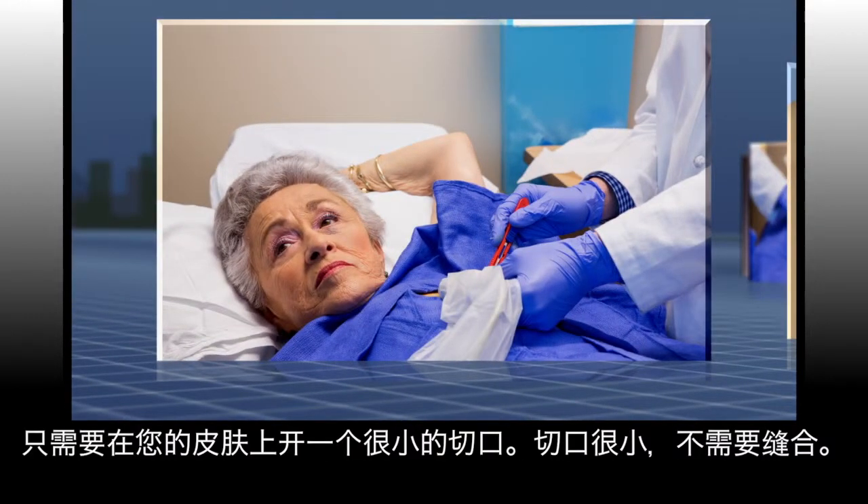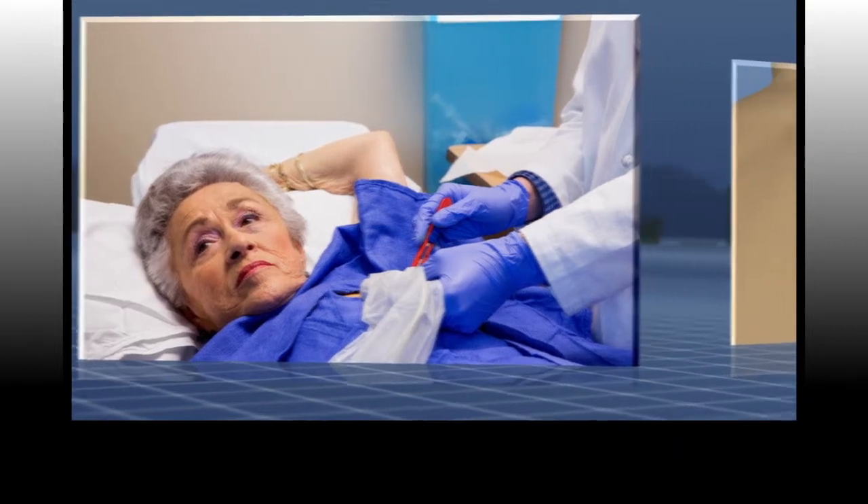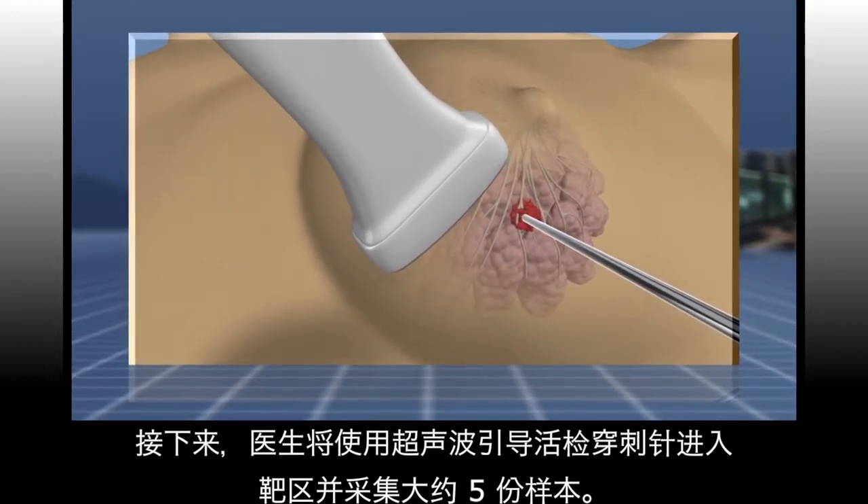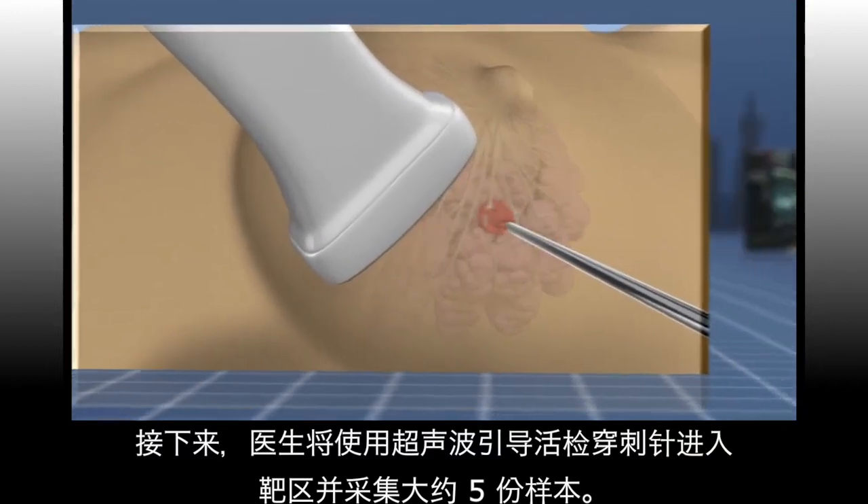An incision so small that it doesn't need stitches will be made into your skin. Your doctor will then use the ultrasound to guide the biopsy needle into the target area and take approximately five samples.